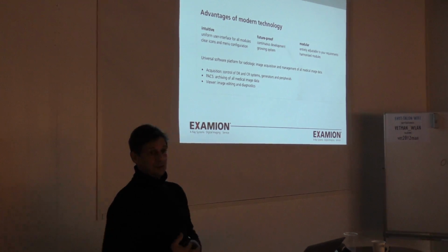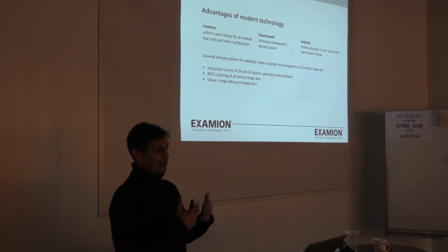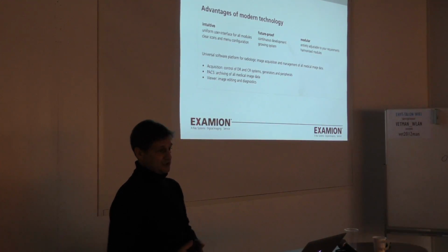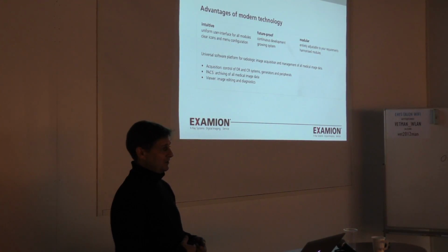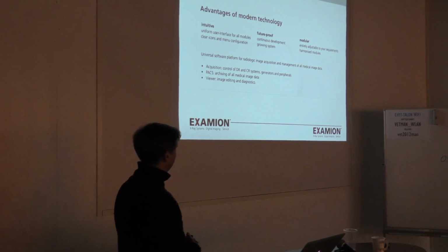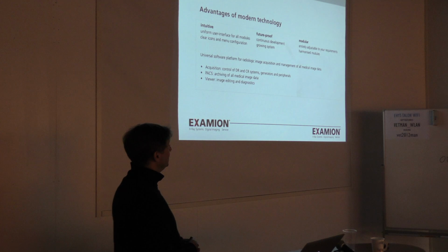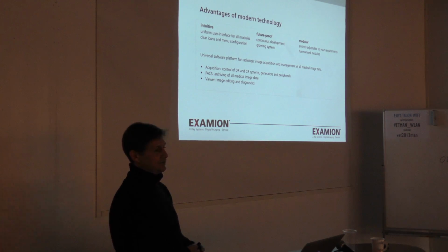Everybody already knows about PACS and DICOM, so if you have all that already integrated into your X-ray machine, it saves you a lot of money of, let's say, having to buy that as a third party and integrating yourself. Integration is always possible, I would say, but it's not always easy. And if you have to spend the money and the time of trying to integrate yourself, it might be very disappointing.